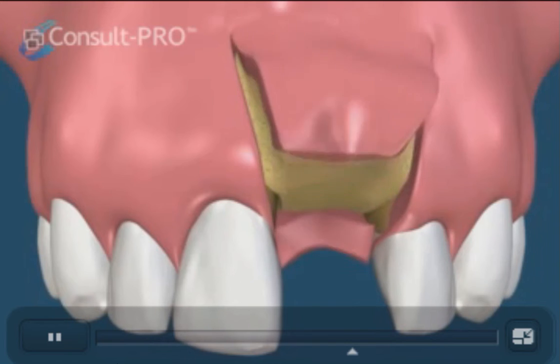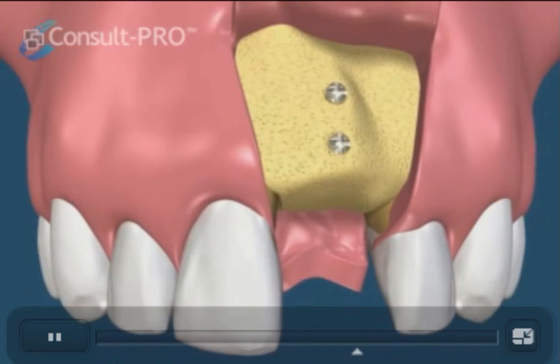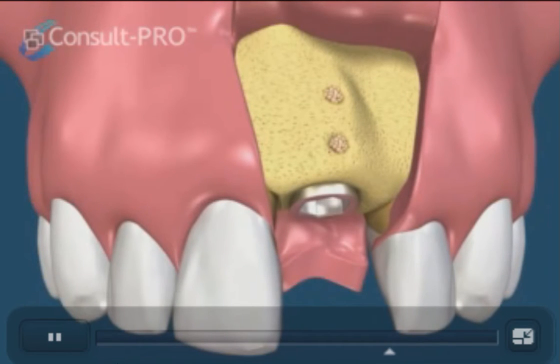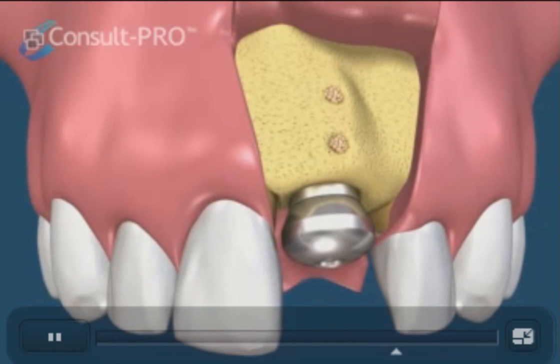At about five to seven months, the area is again exposed with the flap and the bone screws are removed. The access holes can be left or filled with bone particles. Now the bone can be prepared for implant fixture placement, and in this situation a single-stage type of implant placement is demonstrated.